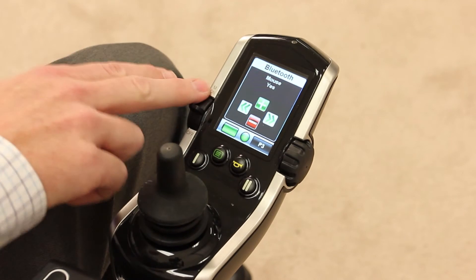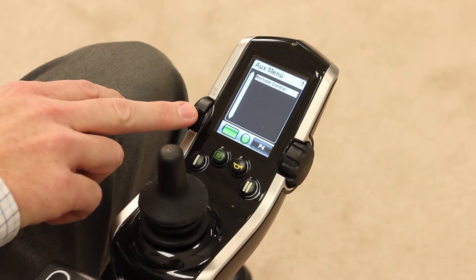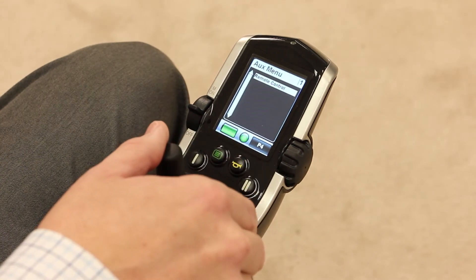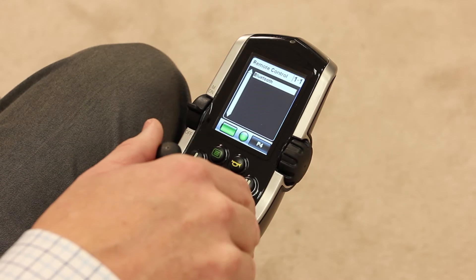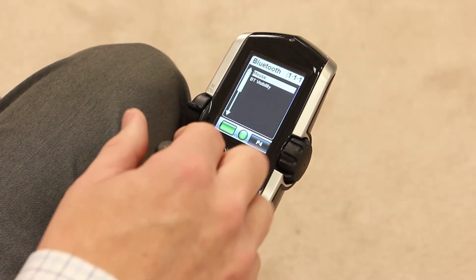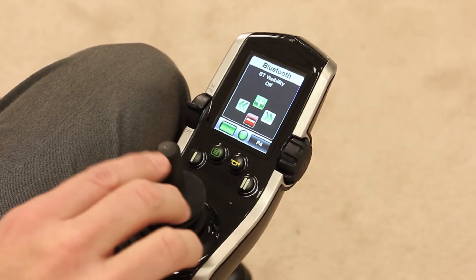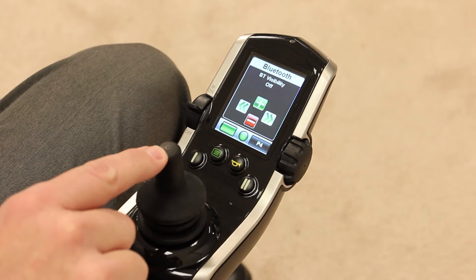We need to push the mode toggle forward until we get to profile 4. You now see that we have an auxiliary menu available and remote control. We're going to give a right command on remote control, then a right command of the joystick on Bluetooth. We have to make the Bluetooth visible, so we want to give a reverse command on the joystick, then a right command. The plus is forward, so that's how we turn Bluetooth visibility on.